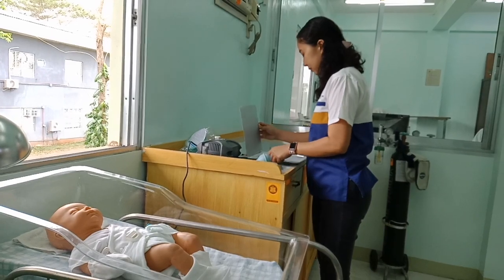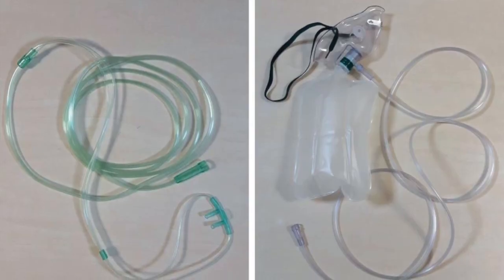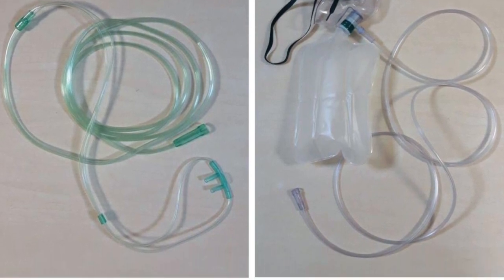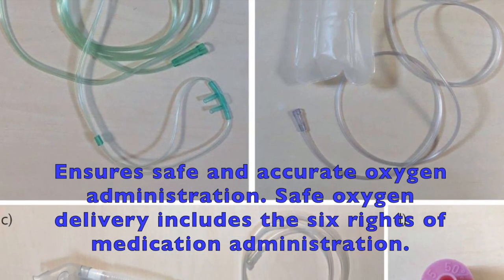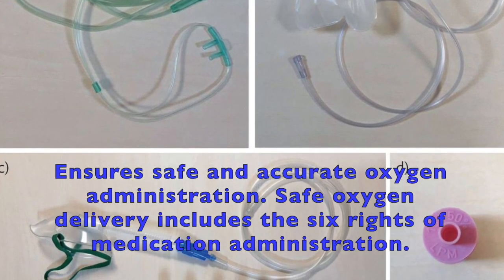Check the doctor's order for oxygen, noting delivery method, flow rate, and duration of oxygen therapy. This ensures safe and accurate oxygen administration. Safe oxygen delivery includes the 6 rights of medication administration.